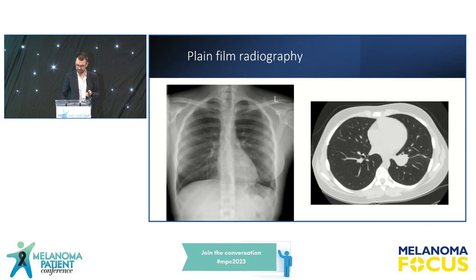Moving on to ultrasound now. Oh, sorry, we've got another x-ray. And this is a patient complaining of a cough for some months. And again, some of you might spot that there's a small nodule just behind the heart here, but that could be tricky to see. Obviously that's much easier to see on the CT scan. And this turned out to be a different type of tumour called a carcinoid or a neuroendocrine tumour. So again, we know that chest x-rays aren't always useful for picking up small deposits in the lung. And in that situation, CT scans tend to be better.